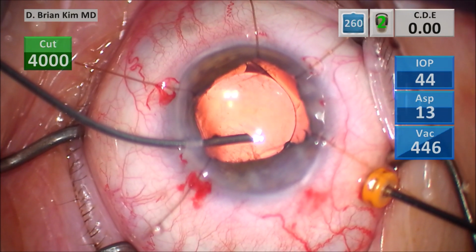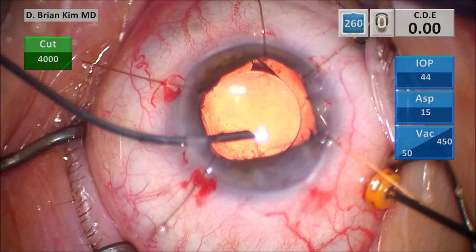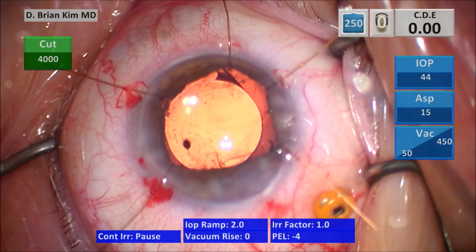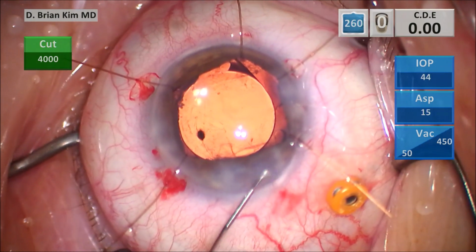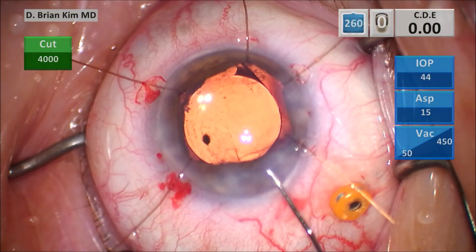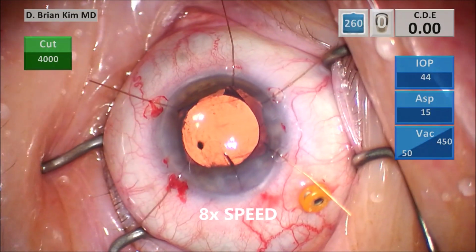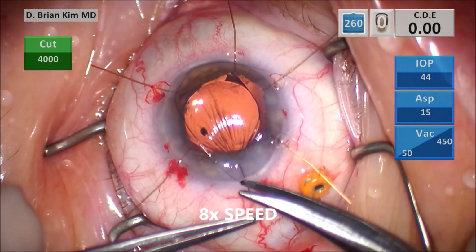Again, I placed the iris hooks for excellent visualization, and really very important to be able to see exactly what's going on. I would have had no idea the actual condition of the capsular bag, the anterior capsule, posterior capsule, without retracting the iris. You can see I went ahead and placed a 10-0 nylon suture because in these situations, the last thing I want to see is vitreous to the wound.